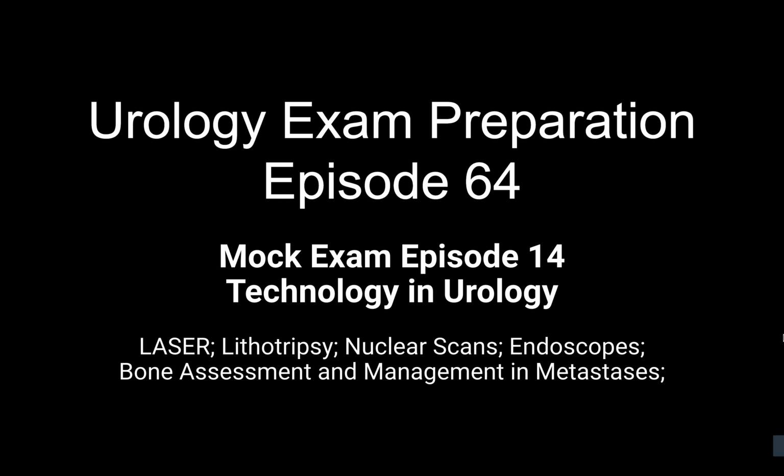Okay. And in your practice, you are using a reusable flexible cystoscope, which needs sterilization between patients. Are you aware of any other newer modalities in this aspect? Yes, I'm aware of disposable flexible cystoscopy, which I've started using in my practice. There are different companies making that. The advantage of this is that it does not require sterilization between procedures, so there is a reduced risk of infection transmission amongst the patients, and they are mostly digital scopes with good picture quality.